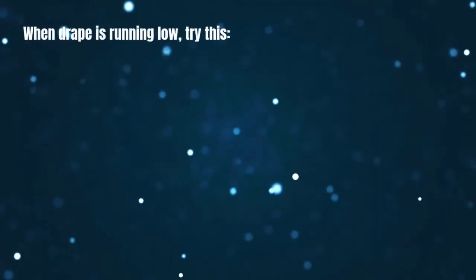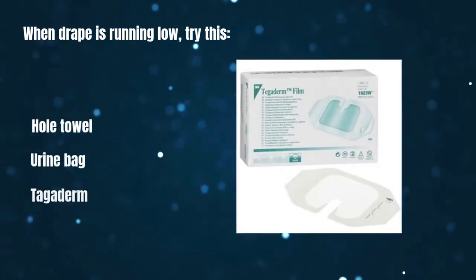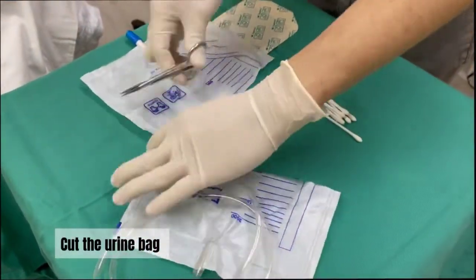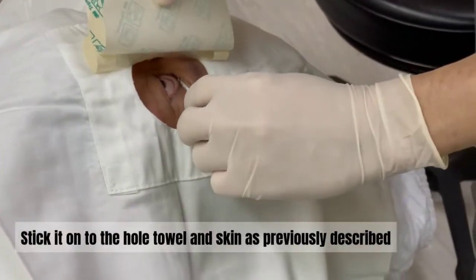If your drape is running low, you can DIY a pouch drape. You just need a sterile hole towel, sterile urine bag, and Tegaderm. First, cut the urine bag. Then stick it to the hole towel and skin.